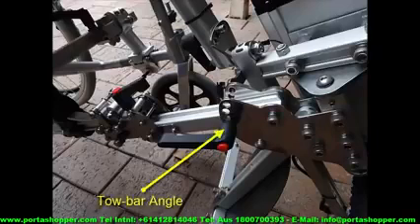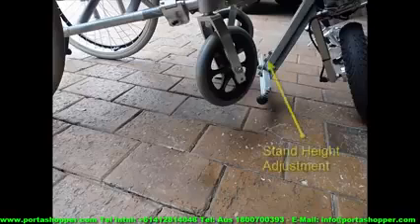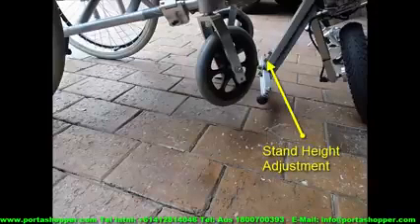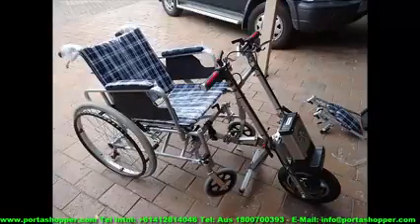Also make sure that the tow bar points downwards enough so you can achieve enough clearance on your wheelchair front casters. The Porter Wheel stand can also be adjusted to make sure your tow bar and tow hook line up perfectly. If you study this picture properly, this is more or less the height that you should achieve on the front casters when hitched up.